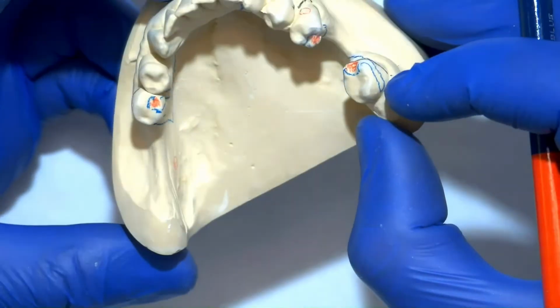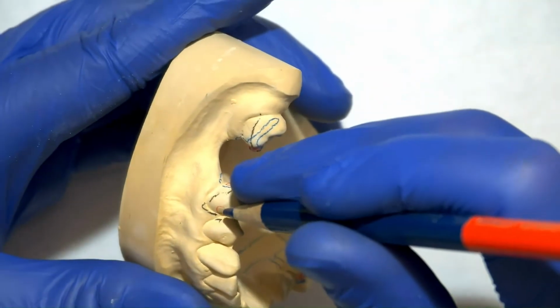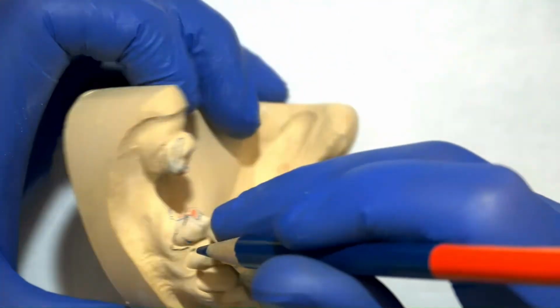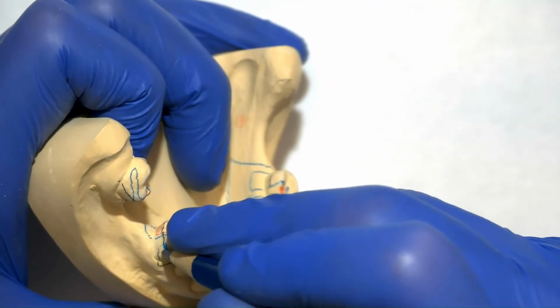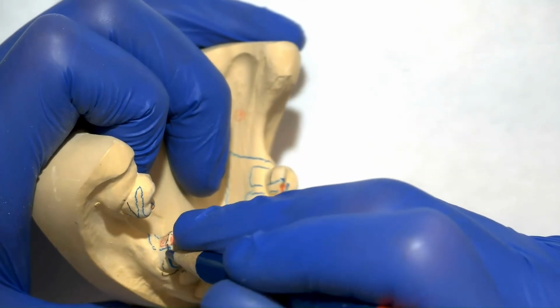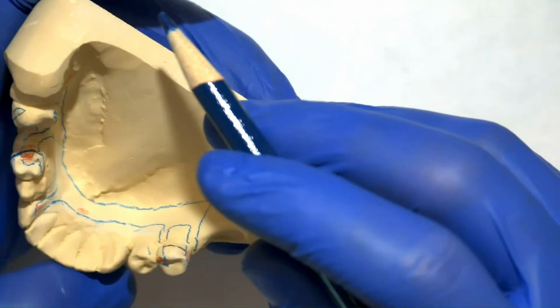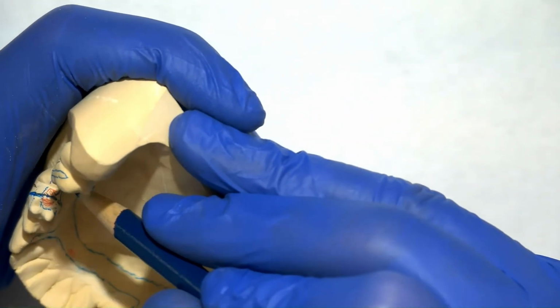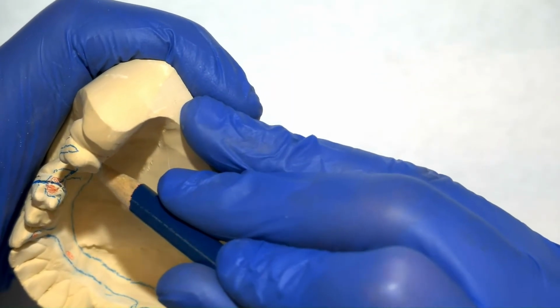And now that we're done with the major connector, it's time to finish up the clasps. So we're going to go ahead and draw that wrought wire here, which is drawn as a solid blue line. We're going to start that, the tip at the undercut, and then go up into our guide plane and back down into the lattice area. Remember, this is an area where we're going to adjust and create that undercut. So we're just drawing it as a plan here.